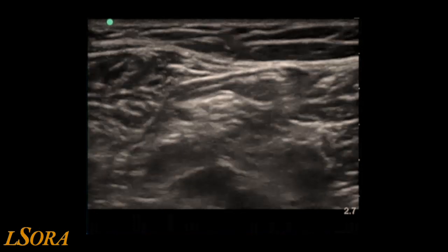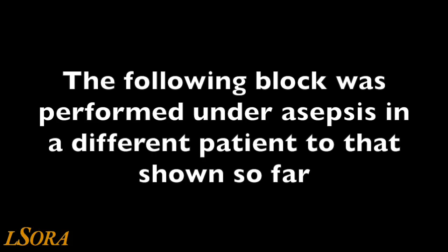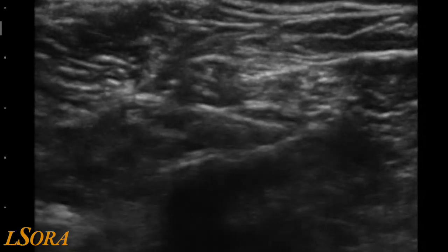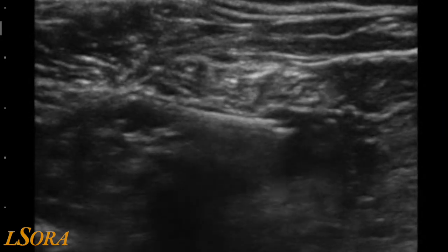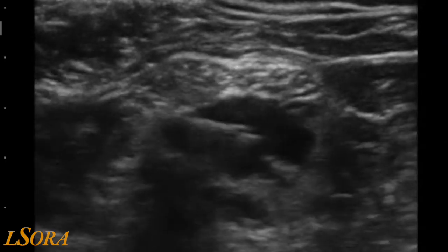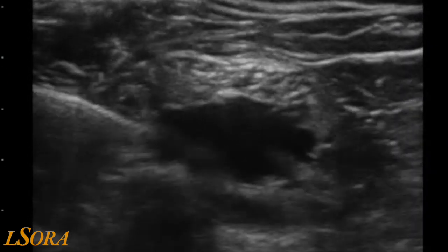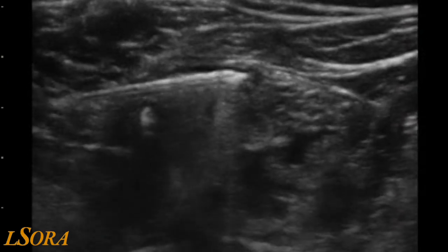Care should be taken with in-plane needling to avoid the popliteal vein, which lies below the neural structures. In an ideal situation, injection below the paraneural sheath would cause local anaesthetic to spread within the paraneural sheath, identifying the two components of the sciatic nerve as separate entities. In this video, you can see the needle being inserted in-plane from the lateral aspect of the thigh. It approaches the common fibular and tibial nerve and injects local anaesthetic below the paraneural sheath. The local anaesthetic distension allows you to clearly visualise the two structures of the sciatic nerve.